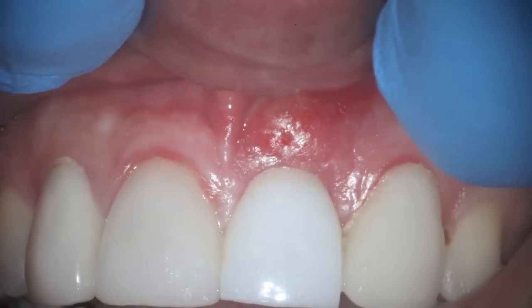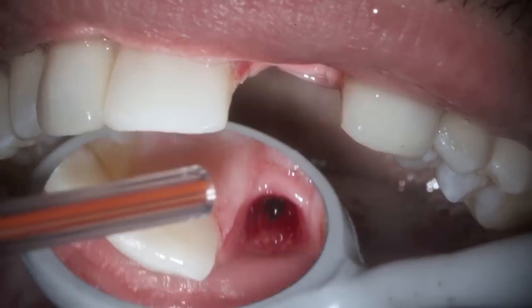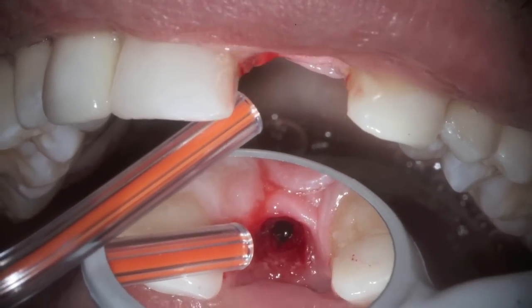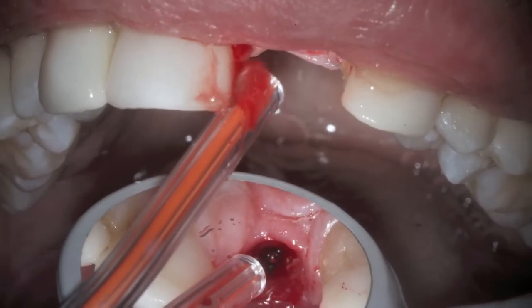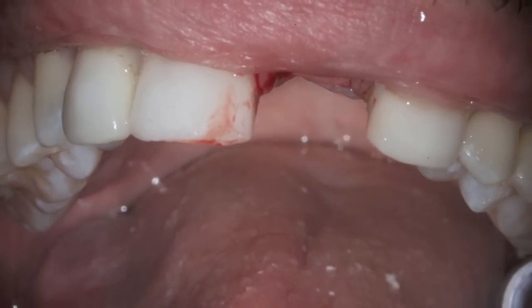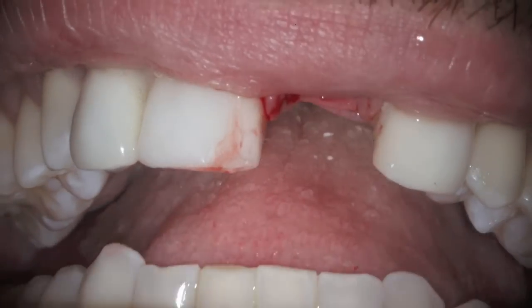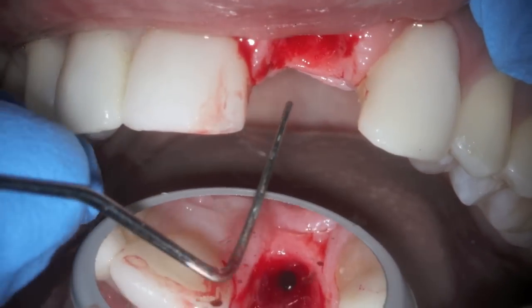The implant itself, there was gum tissue that was covering the implant, and so the implant crown, the temporary crown, wasn't seen the way we would like to see it. We removed a little bit of gum tissue using a laser, and from there we were able to measure.